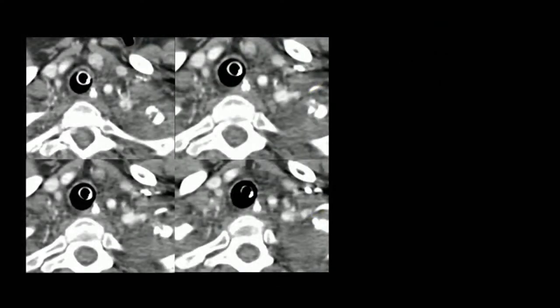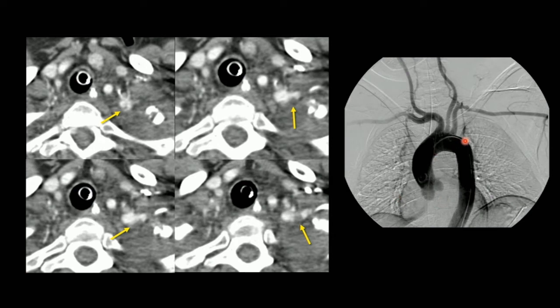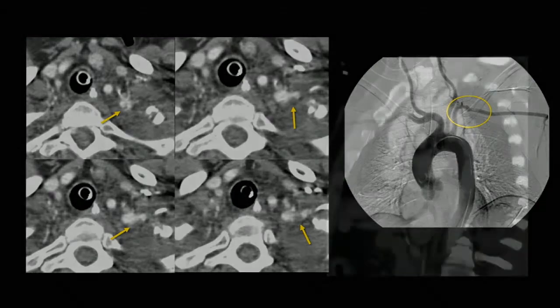Another example of a great vessel injury is extraordinarily subtle. There's a tiny thrombus in this patient's left subclavian artery. You could easily walk right past this if you scrolled quickly. What I start with is a top to bottom look at all of the arteries. This patient ultimately went for angiography which confirmed the finding and received a stent.